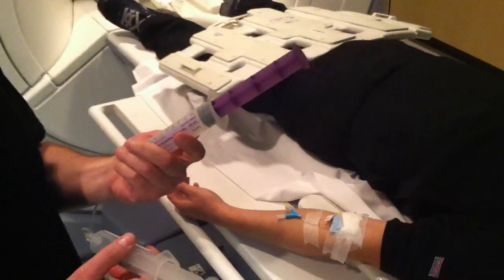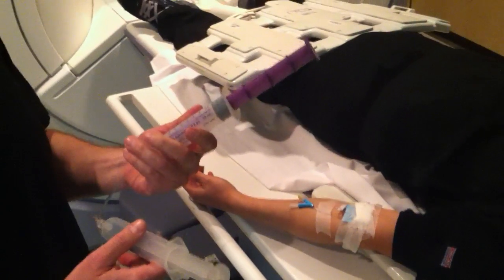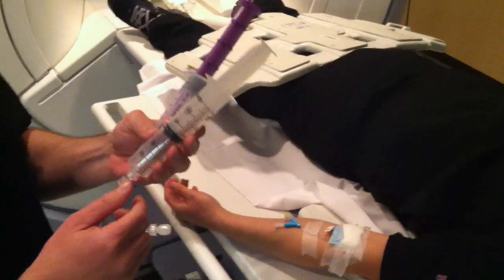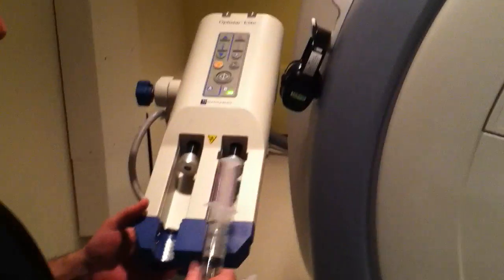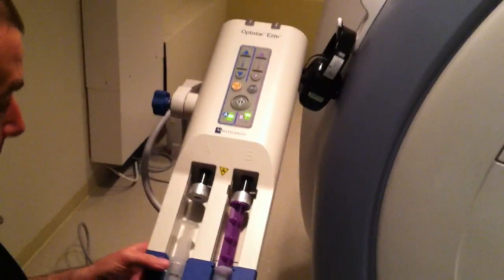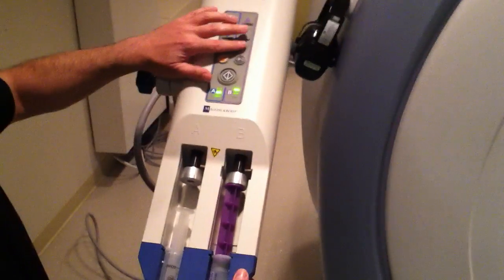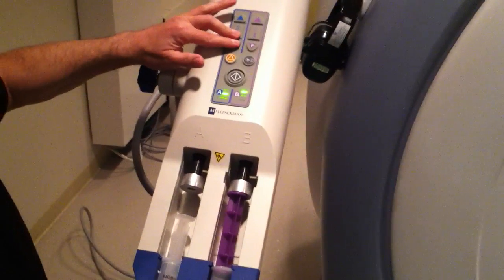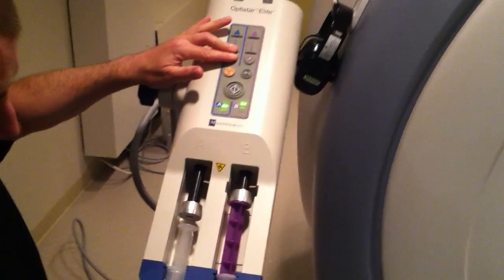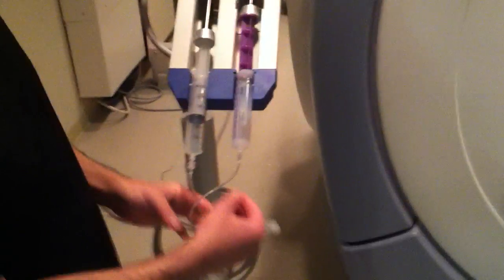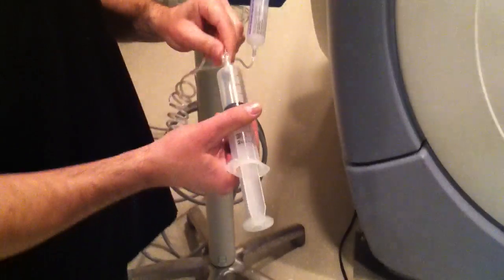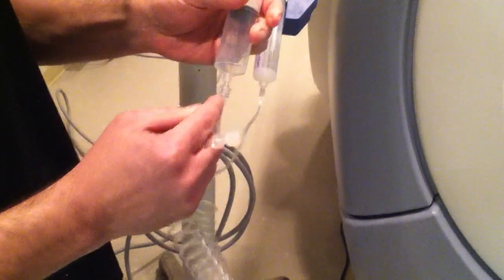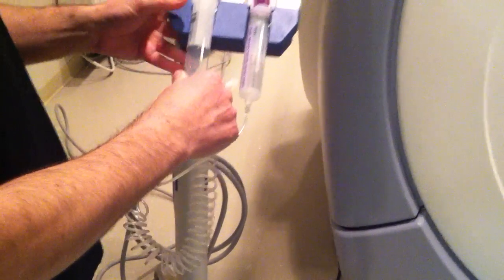What you're going to need is a 50cc syringe of saline and a 30cc syringe of gadolinium. We're going to put these into our power injector, this particular power injector. This model works this way, yours might be different. You'll notice that these are connected by a Y tubing. On this side of the Y tubing, there is a one-way valve. The one-way valve goes on the contrast side.